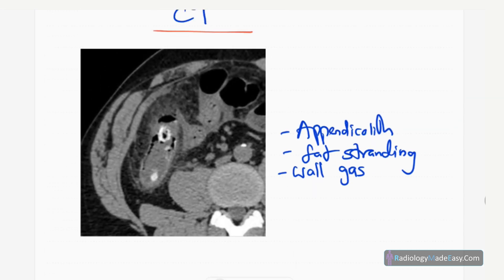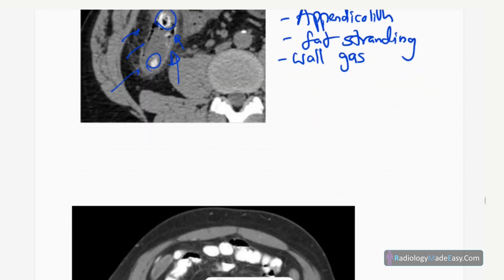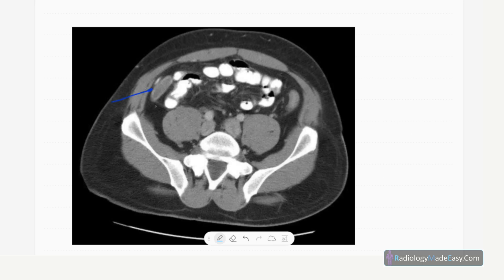CT is the imaging modality of choice in acute appendicitis. Some use non-contrast, others use contrast — with contrast, complications are seen more clearly. On this non-contrast CT abdomen, you can see an appendicolith in the RIF region, a dilated appendix, peri-appendicular fat stranding, and wall thickening — all consistent with acute appendicitis. The cause here is the appendicolith. On contrast CT in the venous phase, you can see wall enhancement of the appendix.